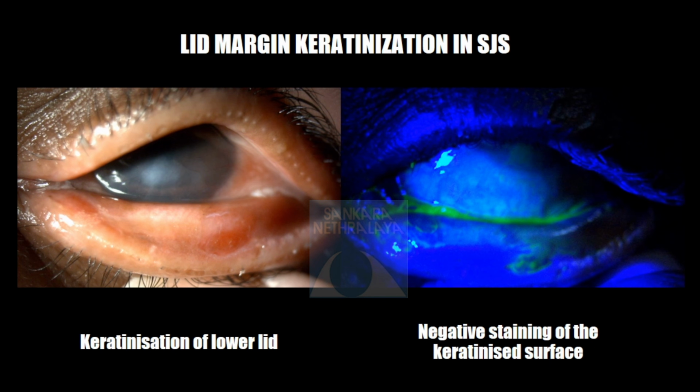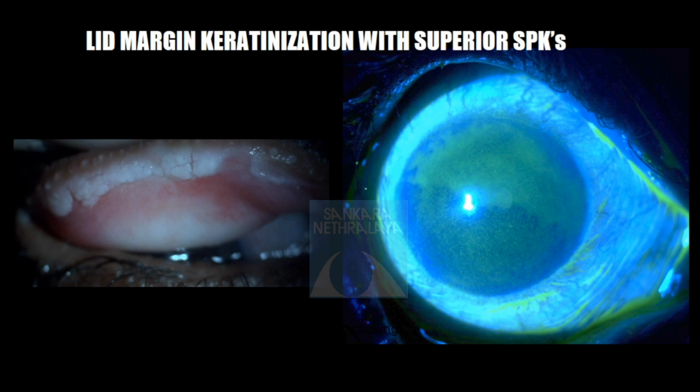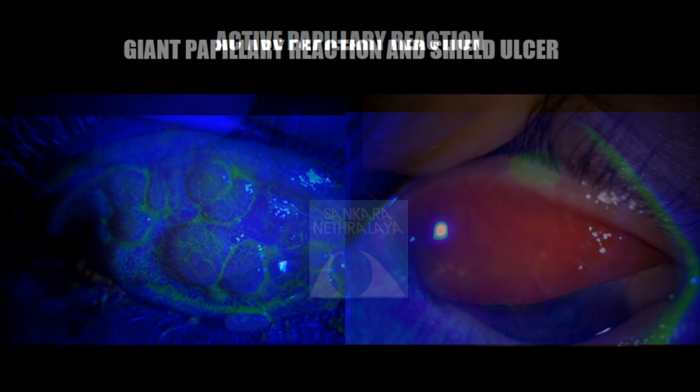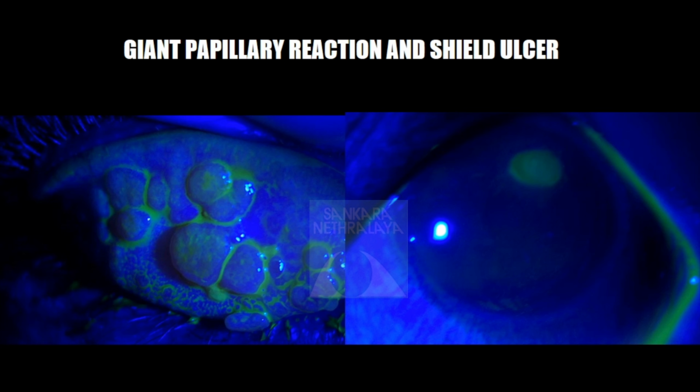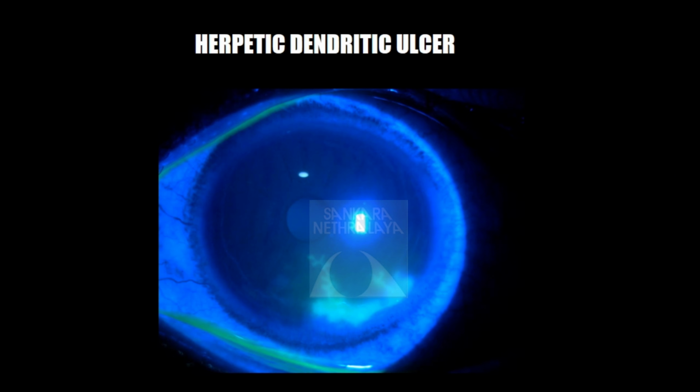In Stevens-Johnson syndrome, the keratinized surface of the lower lid margin appears elevated, causing negative fluorescein staining. The lid margin keratinization can also lead to mechanical trauma of the cornea. In VKC, giant papillae form on the upper lid. Staining of the central core indicates active papillae. Finally, a last note on infections. Dendritic ulcers are characterized by a linear branching pattern with terminal bulbs, which are highlighted by the fluorescein stain.